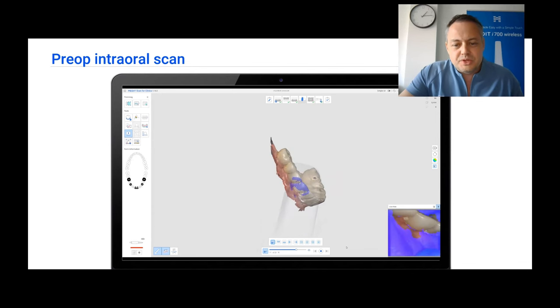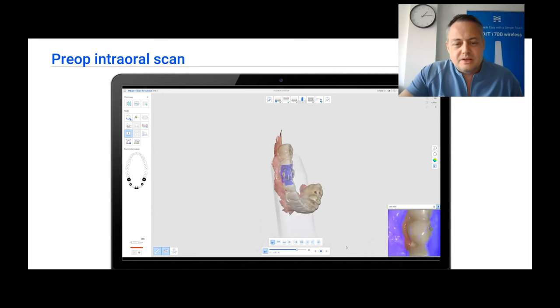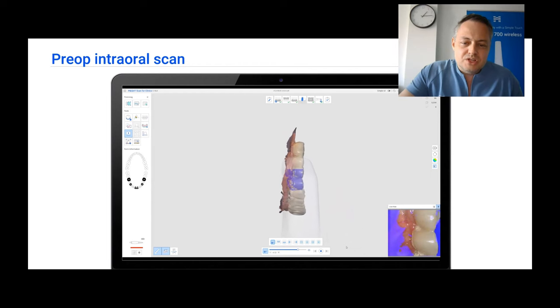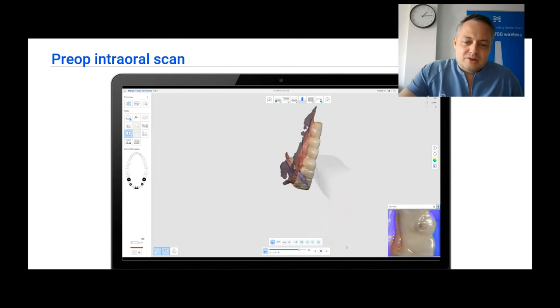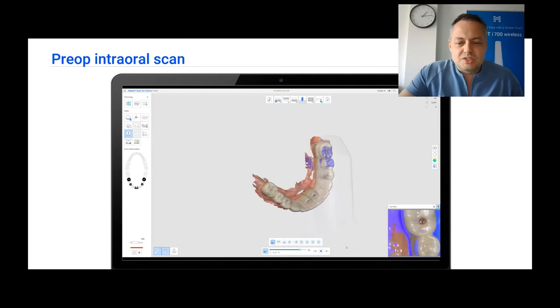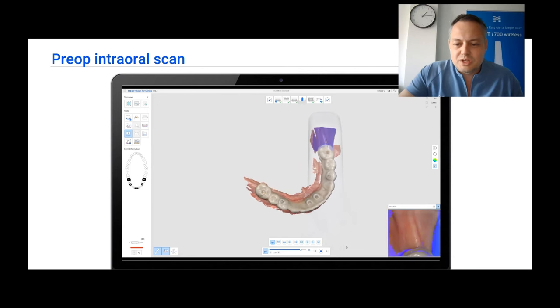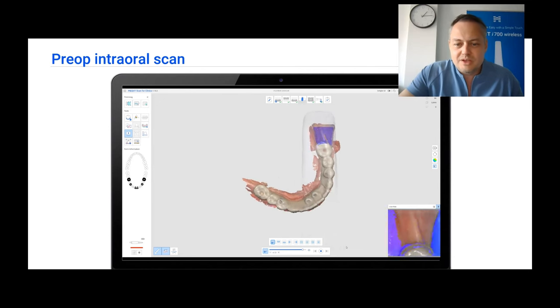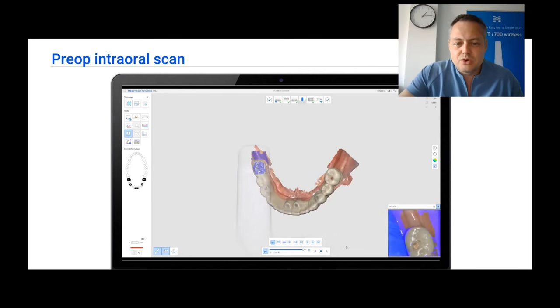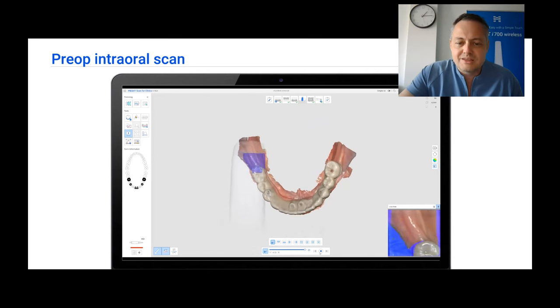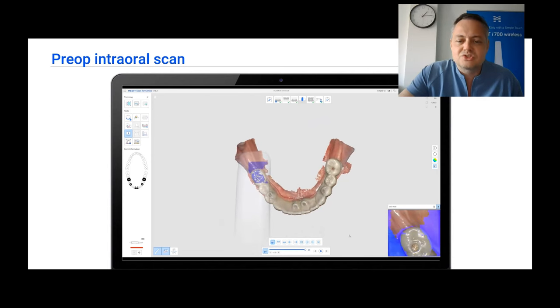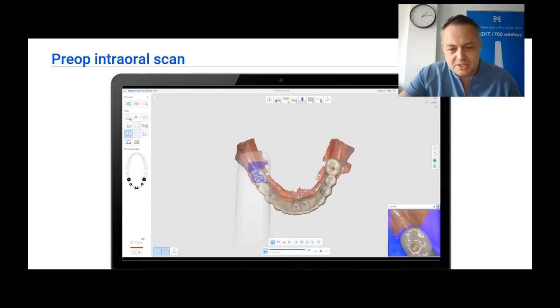As you can see, even if we angle the teeth, we just try to get the lower side of this prosthesis that comes together with this fixed gingiva. And also, after everything is done, we are going to go posterior of this prosthesis and get the fixed gingiva of the rest of the jaw on the distal.